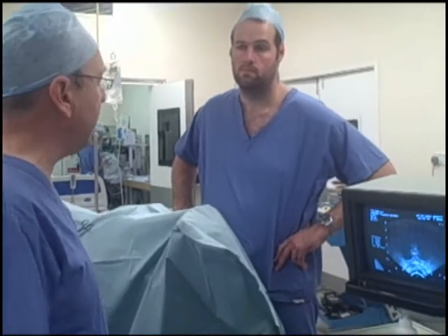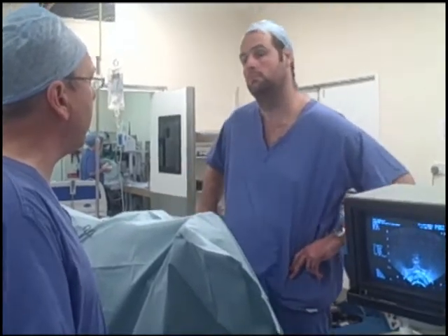It's performed under an ultrasound device to monitor the prostate, and during the procedure we freeze the gland using argon gas through the needles, which freezes the tissue of the prostate to minus 100 degrees centigrade. We then thaw the gland using another gas, helium, which warms it up, and we also protect various areas around the gland to prevent damage using small temperature needles, and the whole system is computerized.